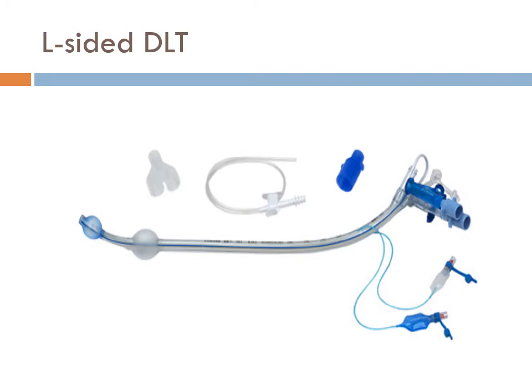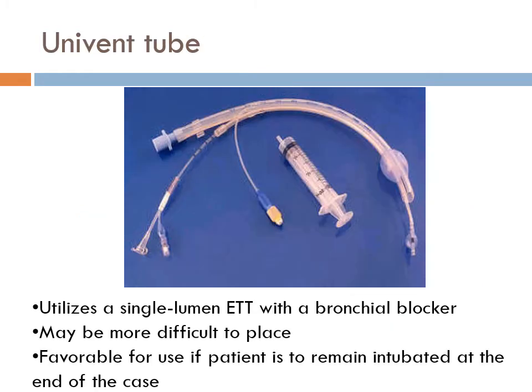You have the tube going around right now, so I'll put this stuff down. Bronchial blocker. And you have double tube. I'm going to take out the stylet so that we can get it ready to ventilate through. So if you're not doing any type of one lung ventilation, all the ports should be closed, right? Close these ports, ventilate through this 2-to-1 adapter. We'll talk more about it.